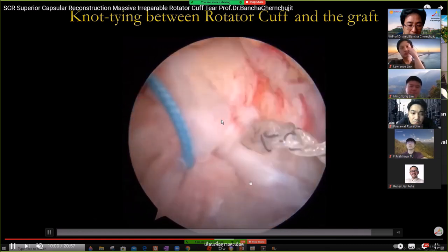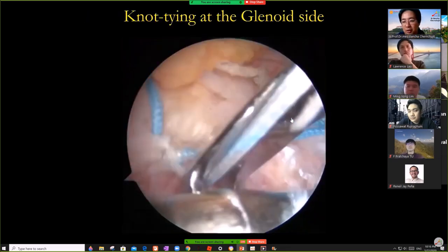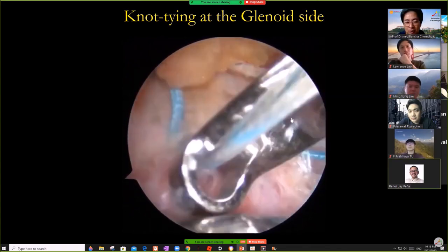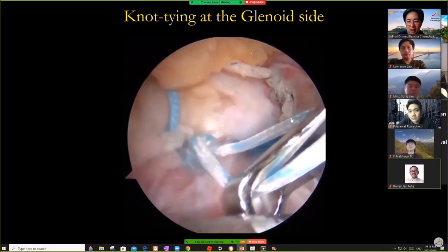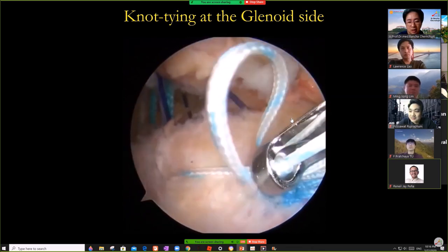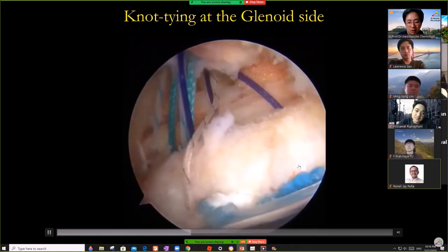One of my fellows, Dr. Tent, graduated two years ago — he also does SCR at his hospital. He does about six SCR patients per year now. Then tie the suture on the glenoid. I think you can understand better now because you have some experience.